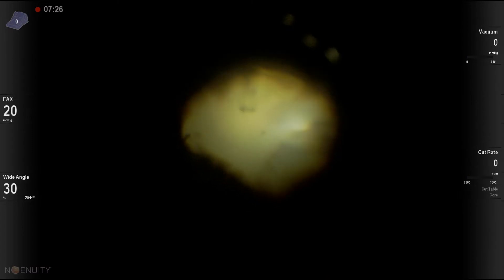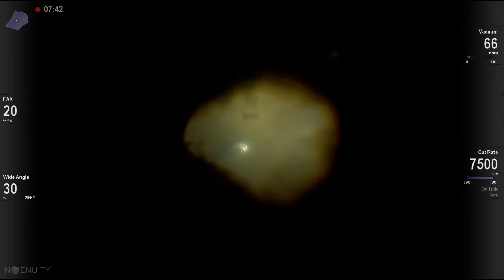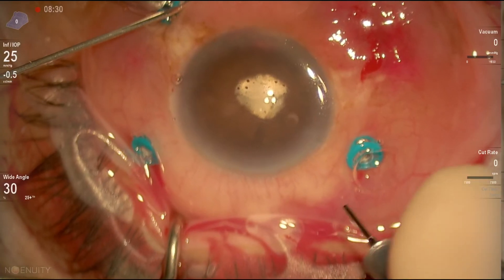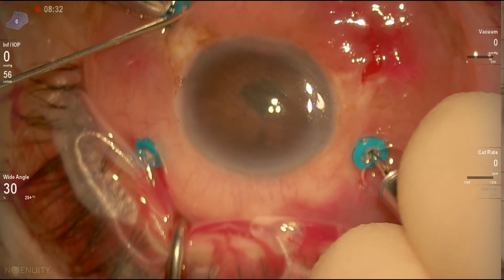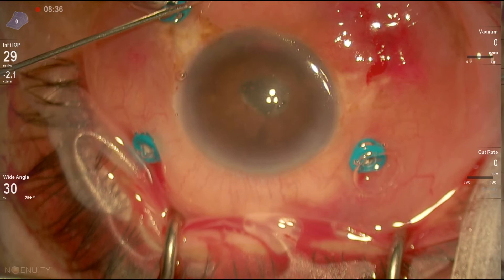I'll leave you the link for a video we have on this technique on the American Academy website. Having completed that, we're venting the air out, which clears the air very quickly. We're back to fluid, as you can see here.